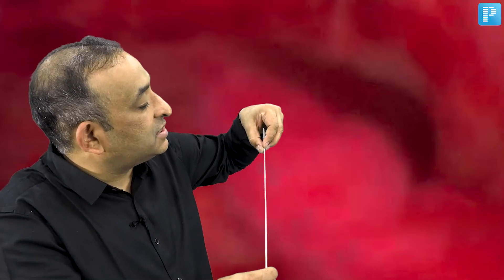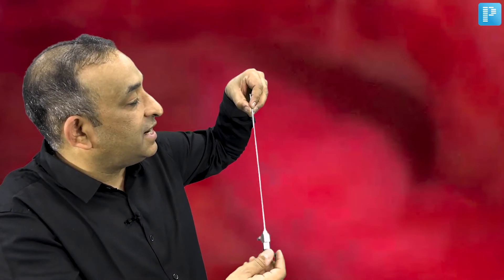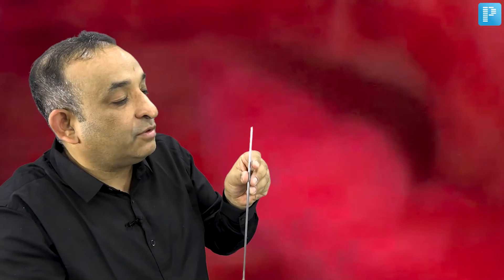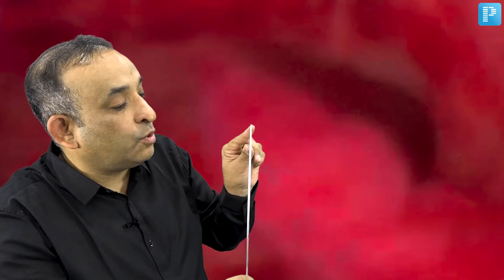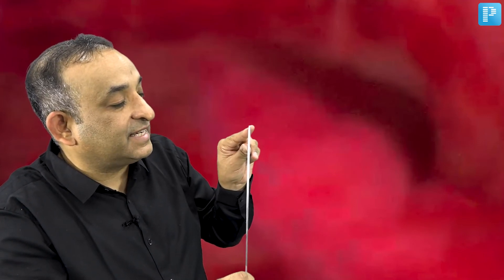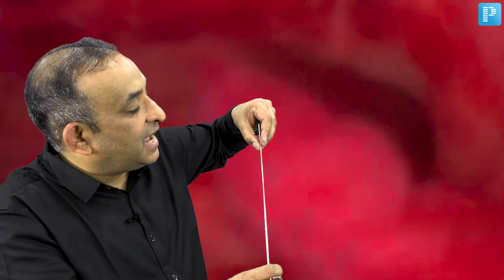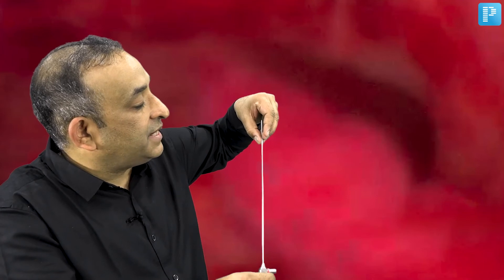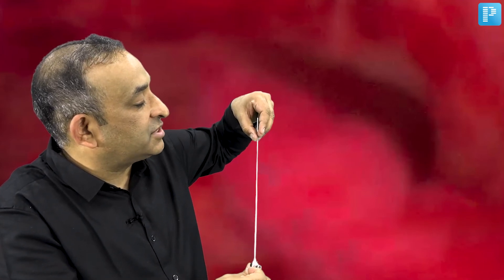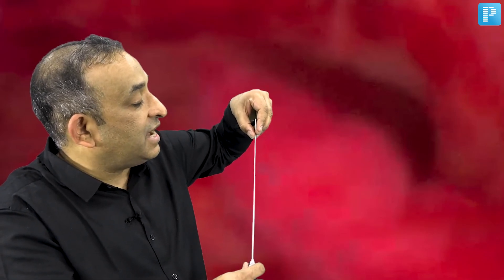Instead, you turn the scope. The lens at the end of the scope is angled at 30 degrees, so by turning the scope one way I can see the right ostium, and by turning it the other way I can see the left ostium. Both ostia are assessed by turning the scope, not by moving it, after which the scope is withdrawn and hysteroscopy is complete.